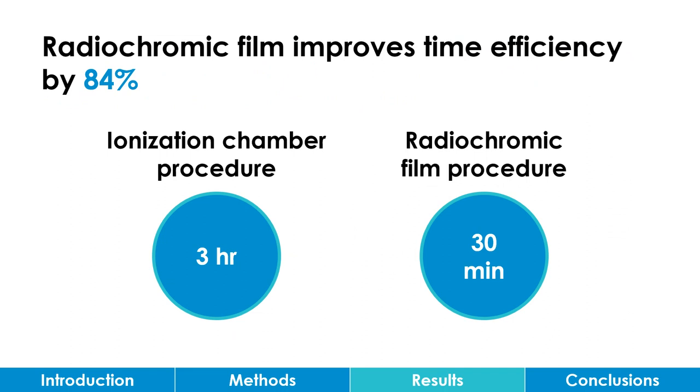And finally, the best part is that the data collection time was reduced from 3 hours in the ion chamber protocol to just 30 minutes in the film protocol.